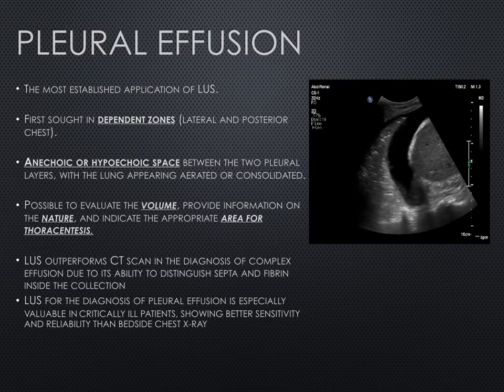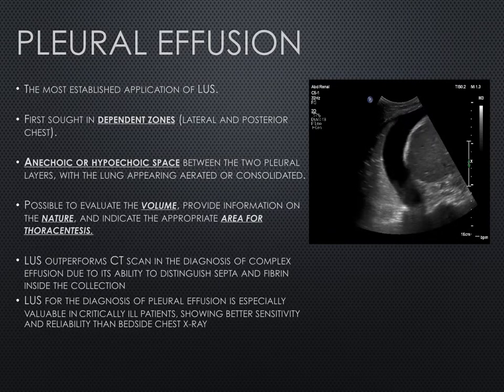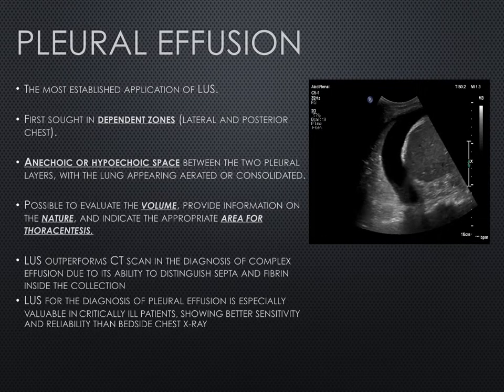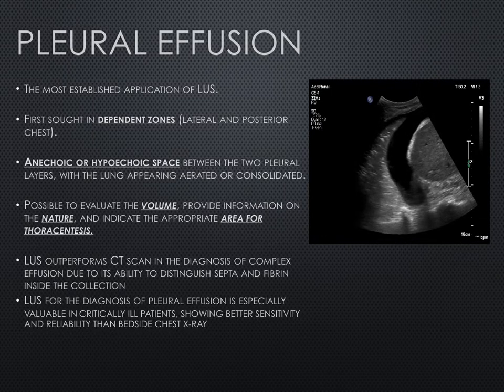And you can see here, looking at the imaging, we can start to identify the level of fluid that is present within that pleural space.